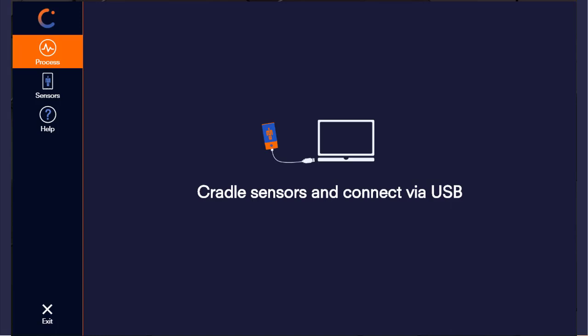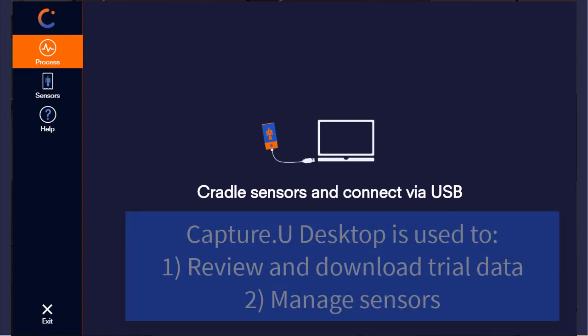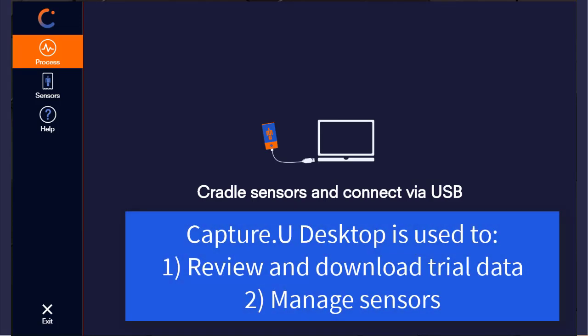CaptureU Desktop has two main functions. The first is to review and download data that has been captured directly to each Vicon Blue Trident sensor, and the second is to manage the sensor.